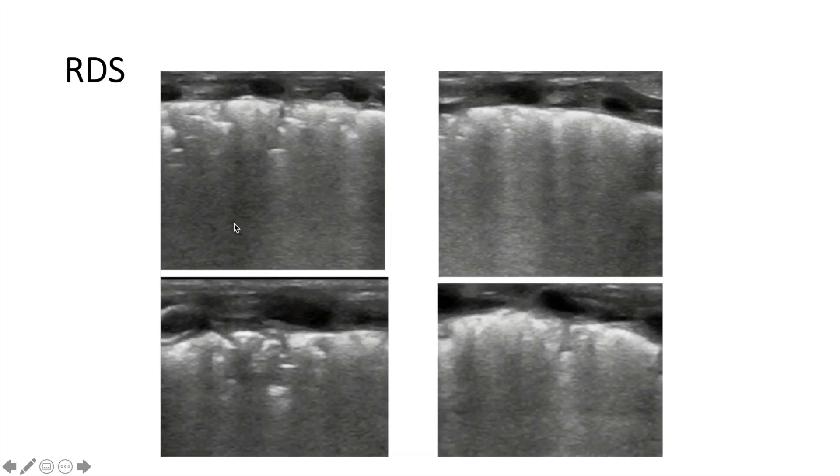The next one is RDS — it's a little bit different. You see more wet lung, basically not very well aerated lung, and the pleura could also be thickened and inflamed. Kind of similar to a BPD pattern.